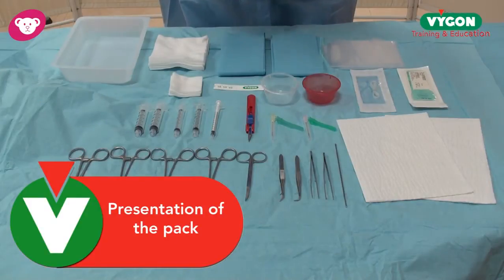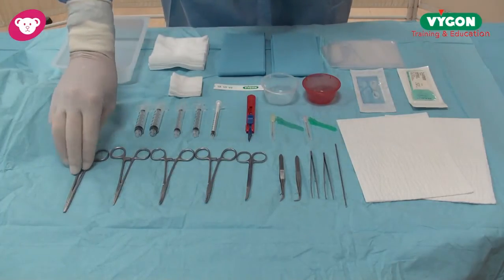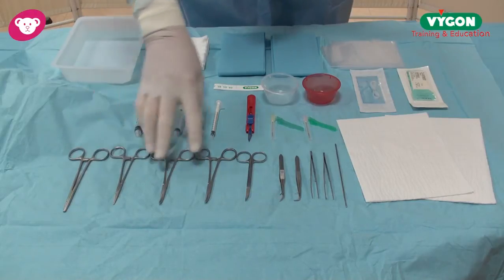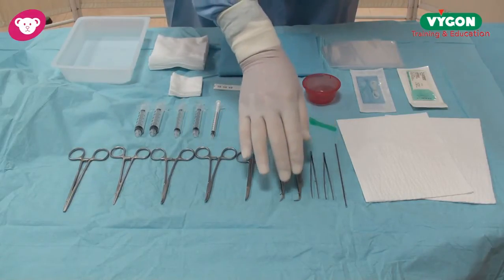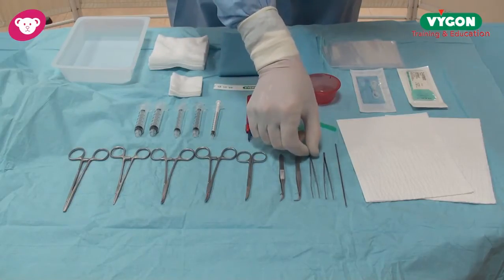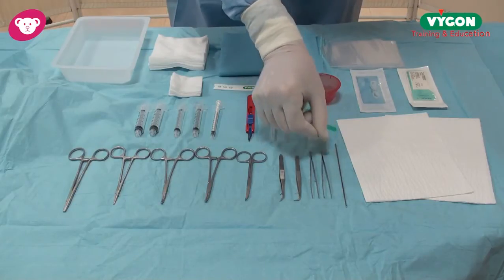Let me show you the Vigon umbilical placement kit. We have a suture holder, we have straight artery forceps, two curved artery forceps, one pair of scissors, and then a selection of forceps — curved to your particular liking or straight — and we have toothed forceps for grasping the umbilical stump.